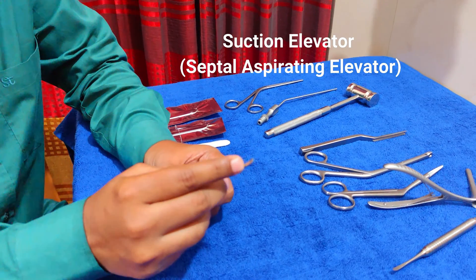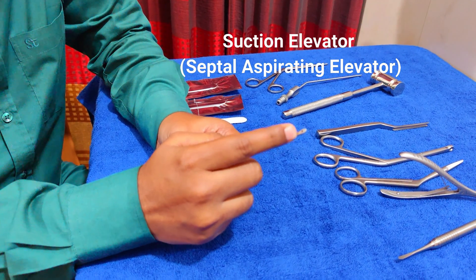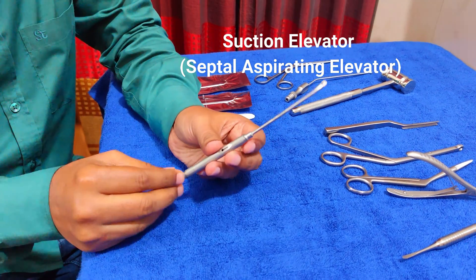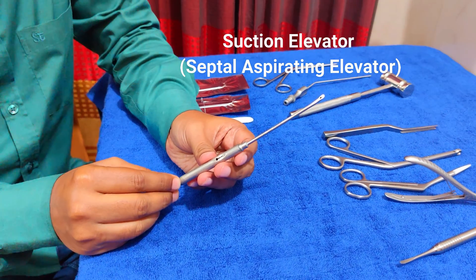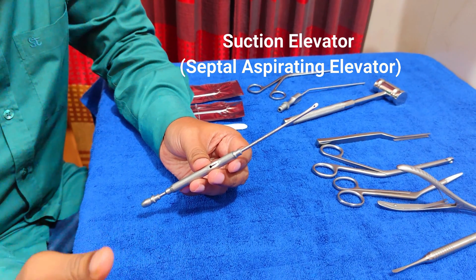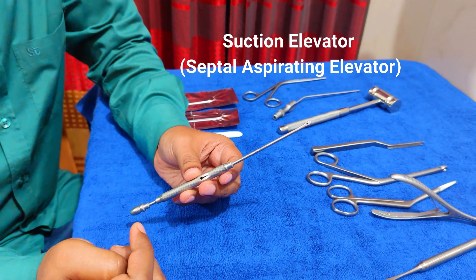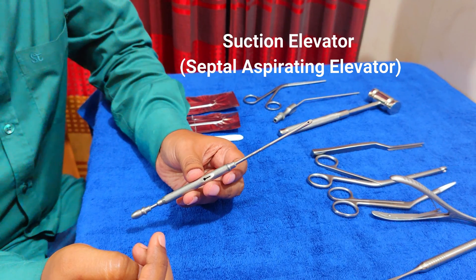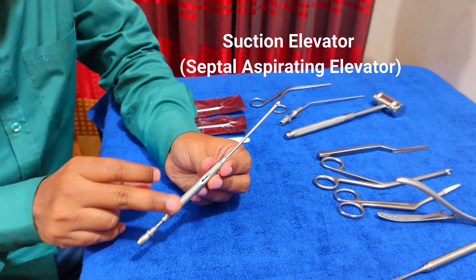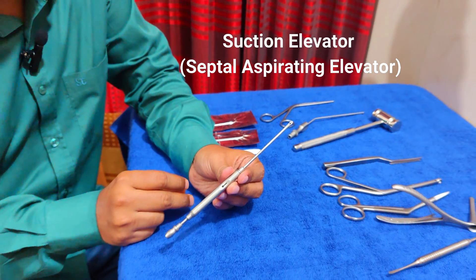The suction elevator is like a Freer elevator but has a side port for suction of blood and secretion. It has the advantage of suctioning blood and secretion during elevation of the mucoperichondrial or mucoperiosteal flap. This instrument is also known as the septal aspirating elevator.